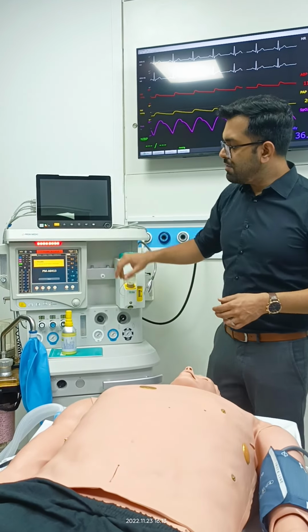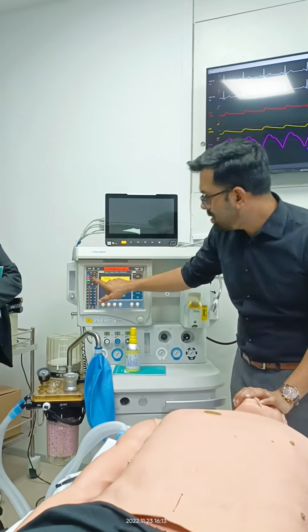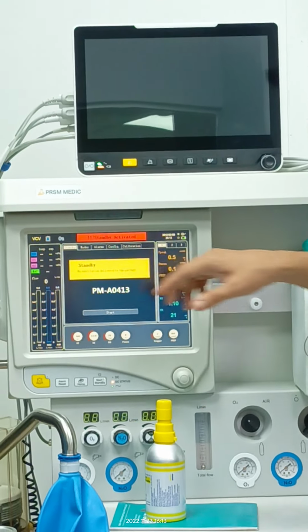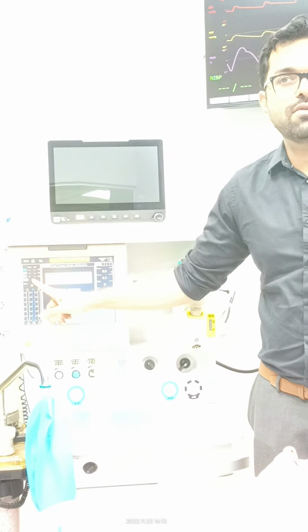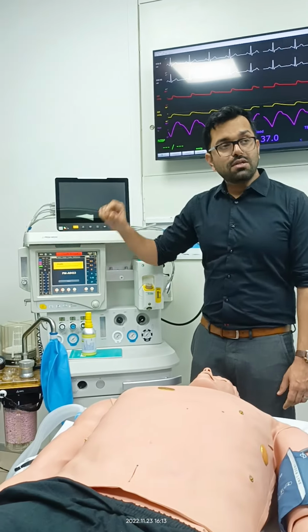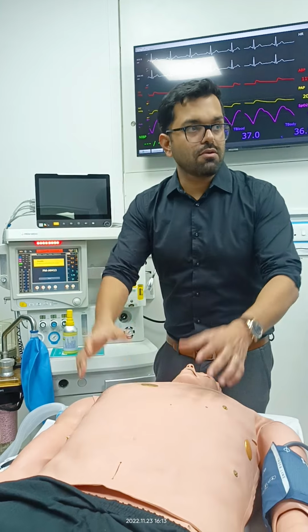Plus, you get a monitor where the concentration of the anesthetic agent is also mentioned. So you get the concentration, MAC value, everything on the monitor. As soon as you stop it, the concentration of the agent in the inspiratory column becomes zero because you're not giving anything. Only the expiratory concentration will be high because the agent gets absorbed by different tissues of the body.